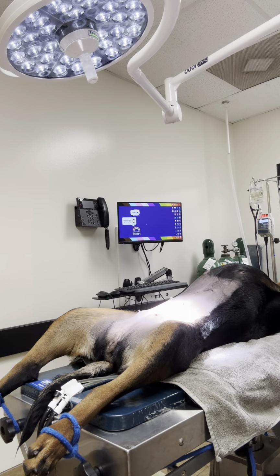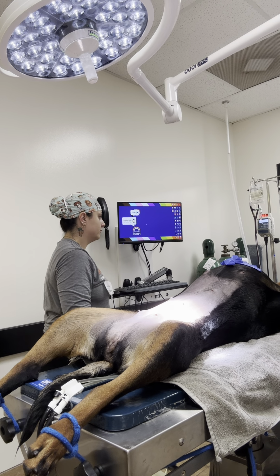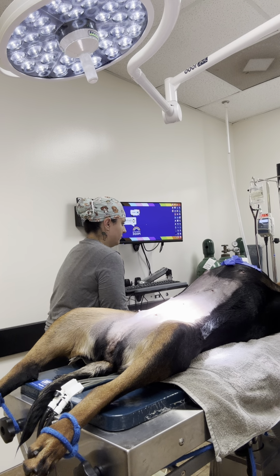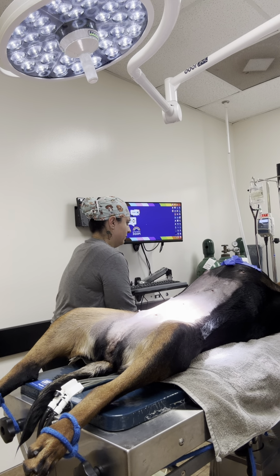This is good. Cool. We've stabilized down to the 140s, so I don't feel like we're gonna end up in the 160s for any protracted length of time. And I feel like we're gonna start coming down. So as we come down, that's when we'll start giving 3/4, maybe down to 2.5. Okay. Because we don't want to bottom through 80 to 70 to 60 to 50. But I have a feeling we have a good runway right now.